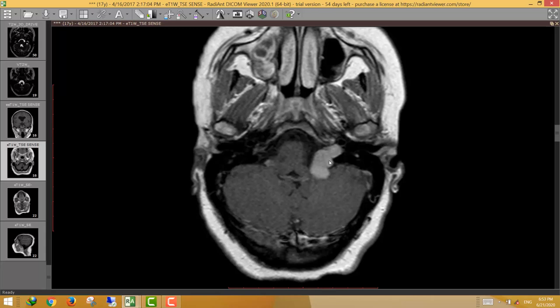The left jugular foramen is the actual passage for the 9th (glossopharyngeal), 10th (vagus), and 11th (accessory) cranial nerves, which arise from the medulla and pass along the jugular fossa. This lesion is therefore a schwannoma arising from one of these cranial nerves — the 9th, 10th, or 11th — though we cannot determine the exact origin.